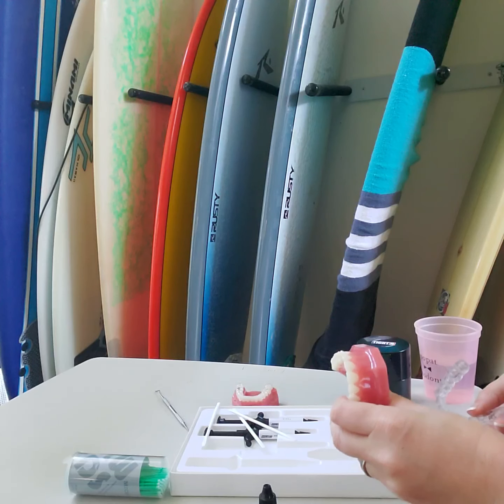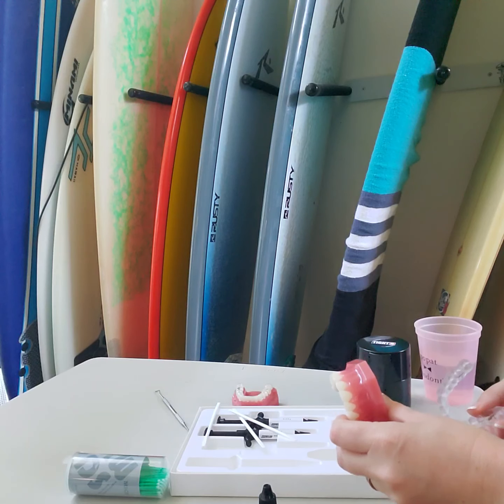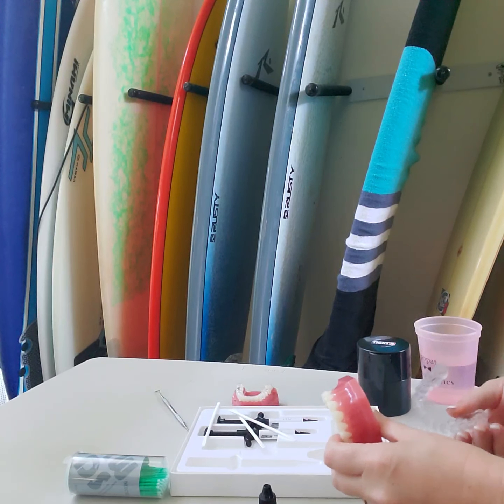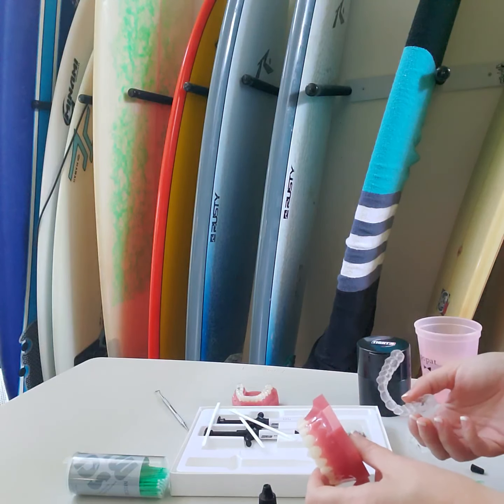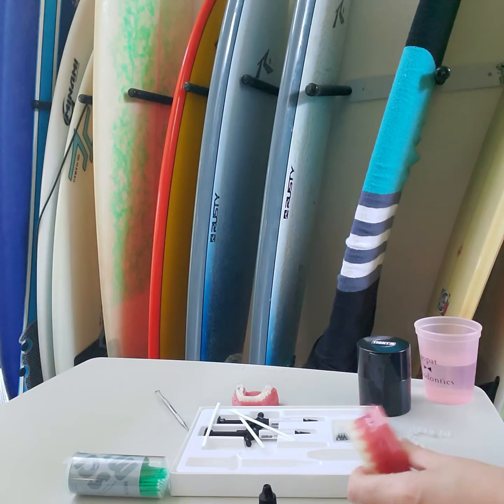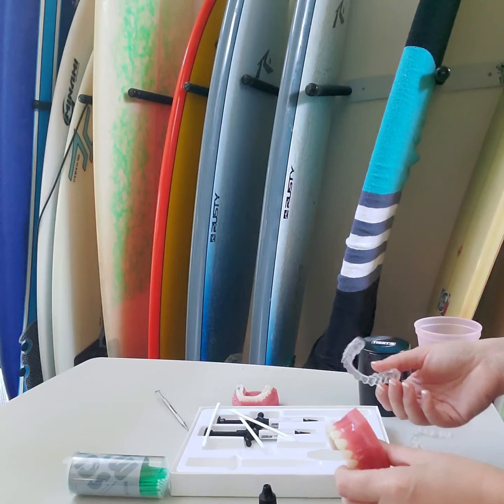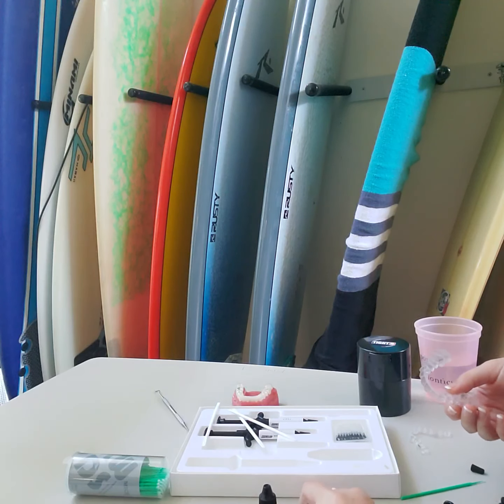If they knock an attachment off, they need to give you a call, stay in that same aligner and come back, and do not progress until it gets put back on again. And if it comes off and they didn't realize it, then you might need to backtrack. Always have your patients save their old aligners. I have a lot of videos about doing that and about tracking too. So hopefully this is a lot of tips for you for having great either Invisalign, ClearCorrect, or aligner outcomes.